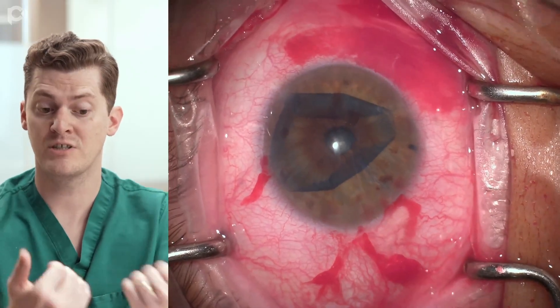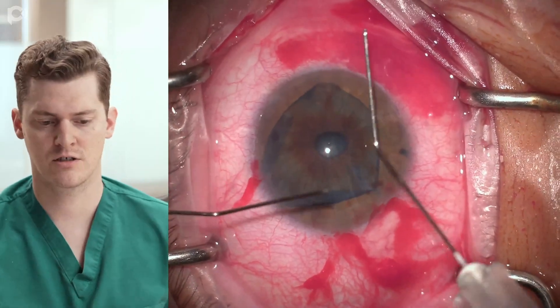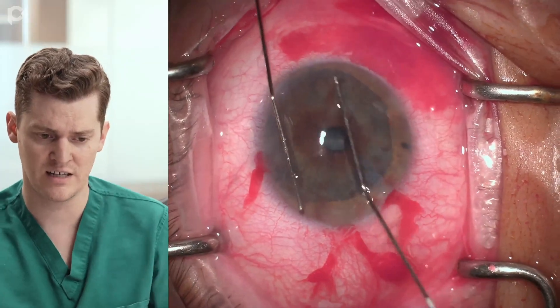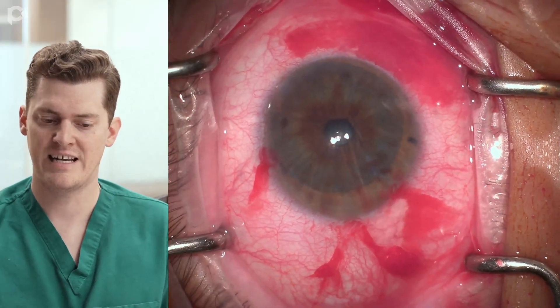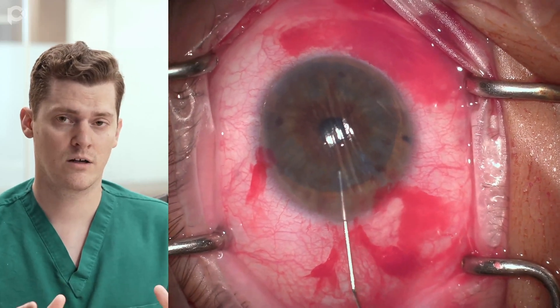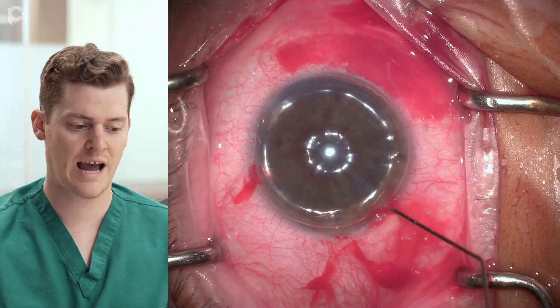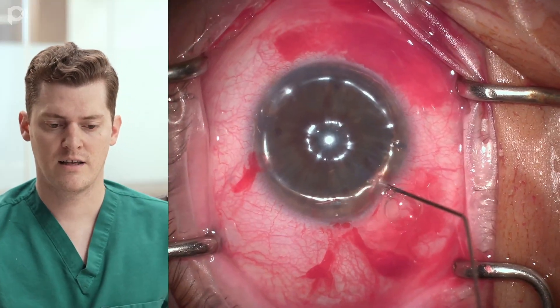Now feeling that the graft is right-side-up in a double-roll situation. I shallow the chamber by going through the main wound, and you can see the attractive forces cause the closer edge to unfold a little better. With the chamber shallower, I can easily tap out those edges in all directions, then shuffle the graft over to get more central and tap out that last edge. The orientation mark is visible supranasally pointing clockwise, confirming the graft is right-side-up. It's shifted a little superior-nasally, which is actually good — it's not interacting with the main wound and makes rebubbling easier in clinic. We lift the graft with an air bubble, confirm the appropriate meniscus and eye pressure, and the case is concluded.